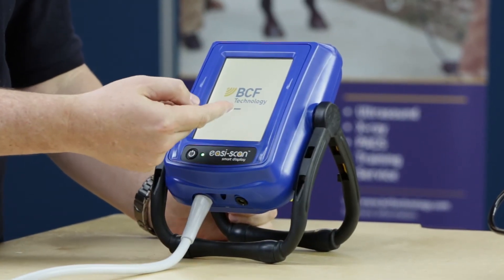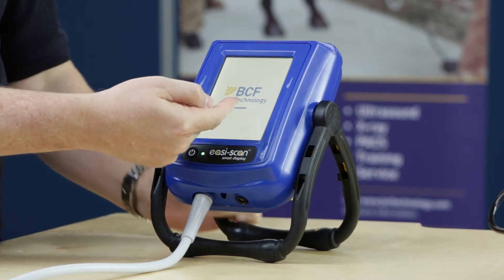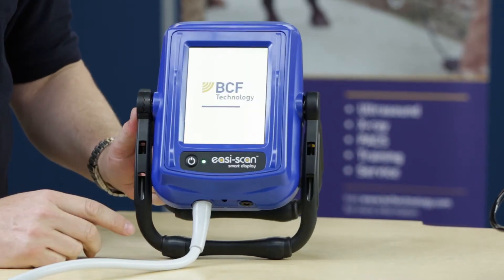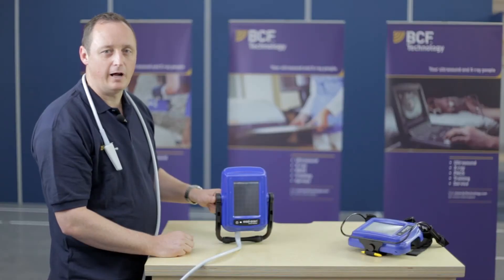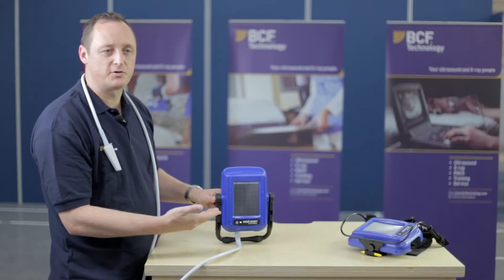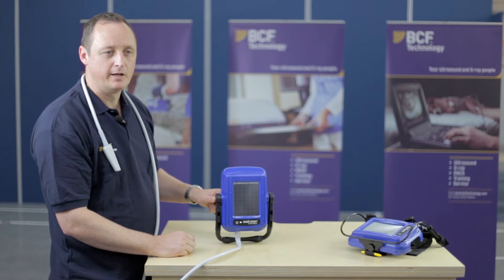It will then go through a boot-up sequence and you'll be able to see the progress of the actual boot-up cycle. Once you've turned your system on and it's booted up, you would then be presented with this particular screen. It is a touch screen, so you can then adjust your menus.